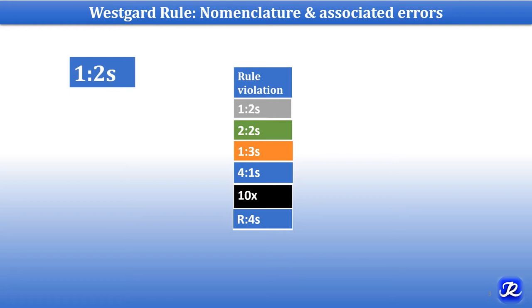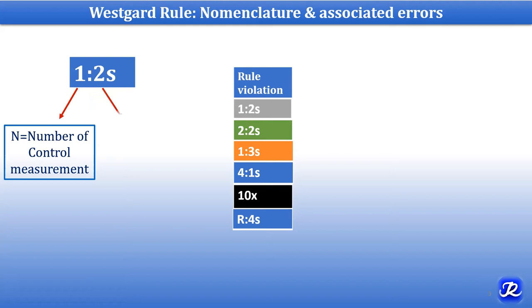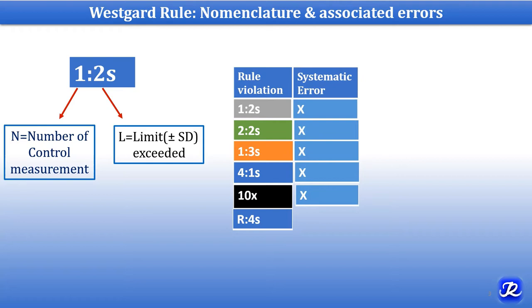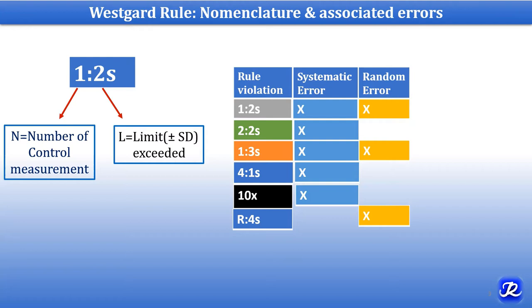Let's understand the nomenclature. For example, in 1-2S, the number 1 represents N, that is the number of control measurements, and 2S represents the limit exceeded, which can be ±1, 2, or 3 standard deviations. The rules 2-2S, 1-3S, 4-1S, and 10X — rule violations of 2-2S, 1-3S, 4-1S, and 10X — denote systematic error.